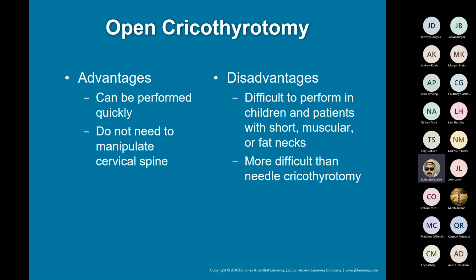It's supposed to be able to be performed quickly, but it takes a little bit more time because we have to get our nerve up to do it. You do not have to manipulate the spine. It's a lot easier if you can tilt that patient's head back to where you can really see their trachea protruding a little bit. It's going to help you a lot, because everything we're trying to find is based off of feel.